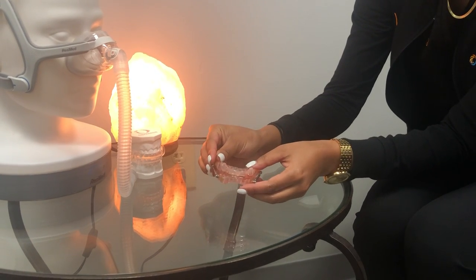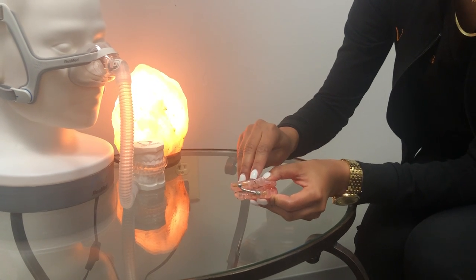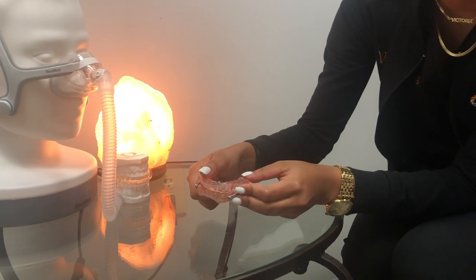This is our Herbst appliance. On both sides there are black arrows — this one's pointing up and this one's pointing down, and that is the direction in which you will make the adjustment.